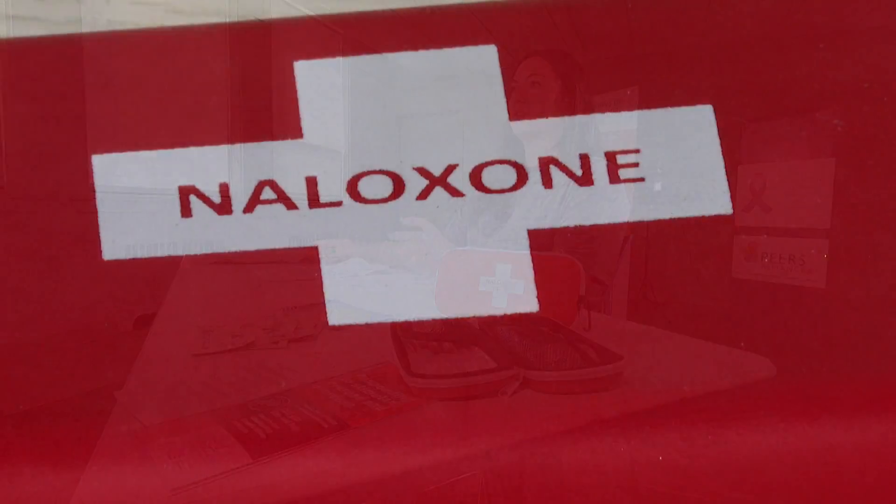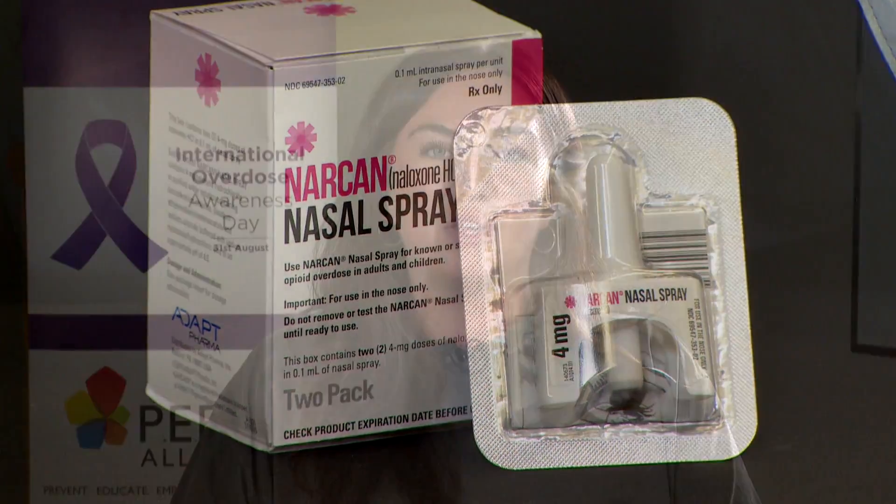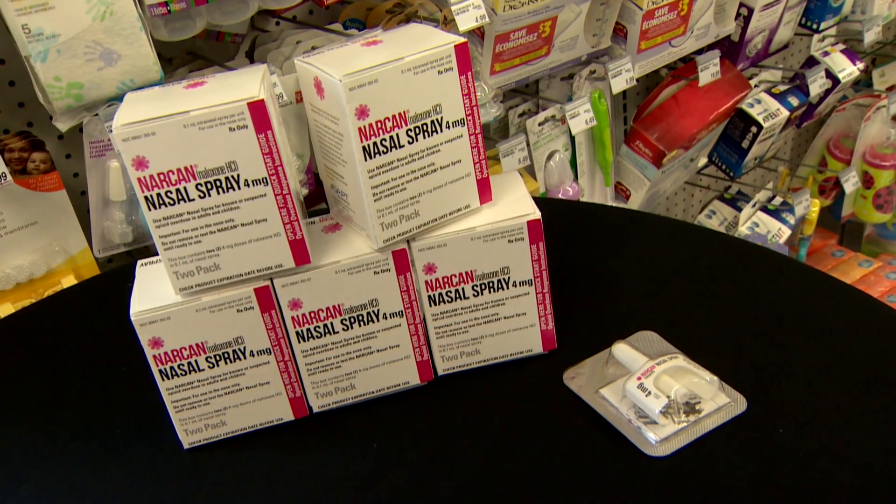There are two different types of naloxone kits: an injection as well as a nasal spray. With the nasal spray, you would tilt the individual's head backwards, put the device up into their nostril, and then give one firm spray. The entire dose of naloxone will then enter their system.